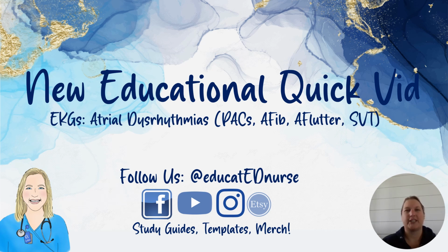Hi, my name is Erin from Educated Nurse and welcome back to our EKG series. I'm doing another educational quick video. Today we're going to hit on atrial dysrhythmias. We're going to look at atrial fibrillation, atrial flutter, premature atrial contractions, and SVT, which is supraventricular tachycardia.